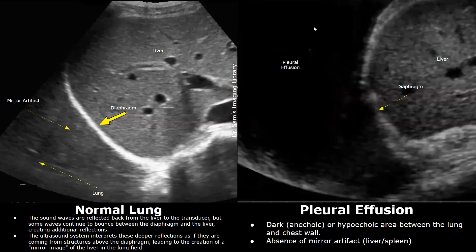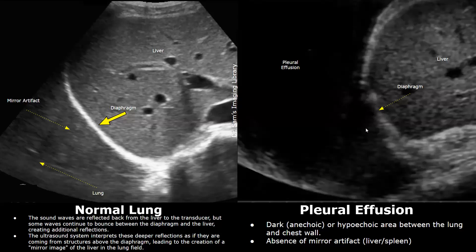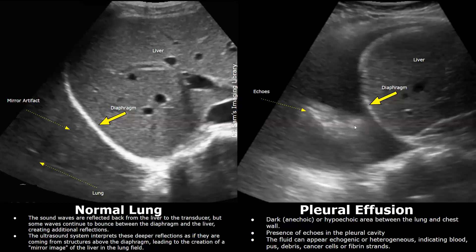In cases of pleural effusion, when there is an abnormal accumulation of fluid in the pleural cavity, we will normally see an anechoic fluid above the diaphragm. If the fluid is clear, we will simply see a jet black area above the diaphragm — an anechoic area. This appearance indicates pleural effusion. The mirror artifact will not be seen; there is absence of a mirror image of the liver or spleen.